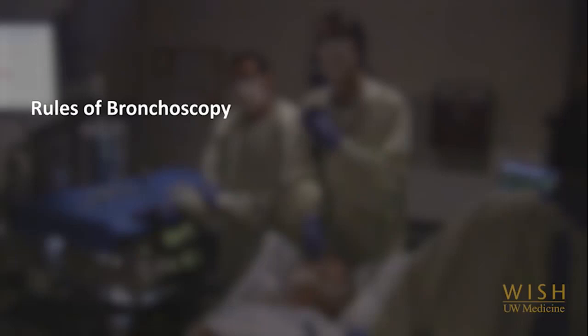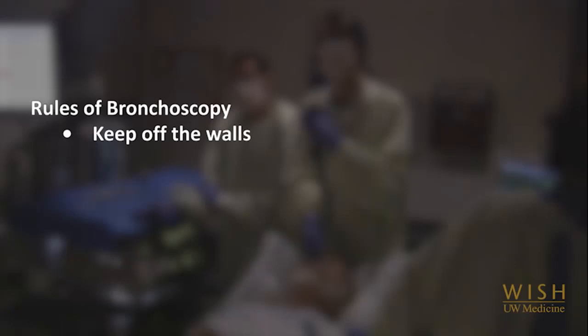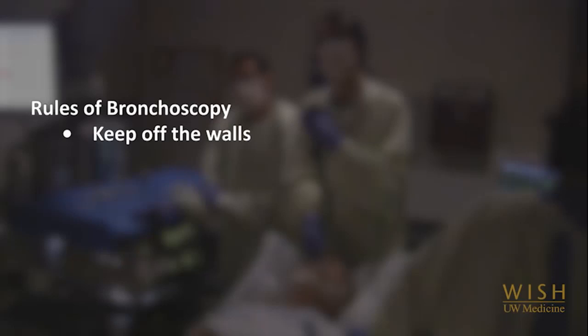During the movie, note how the bronchoscopist abides by the rules of bronchoscopy. Keep the tip of the bronchoscope in the centre of the airway. This reduces trauma to and irritation of the airways. Keeping the image in the centre of the screen also helps those watching you to know where you are and to feel less dizzy. If you cannot see where you are going, advancing could lead to trauma.